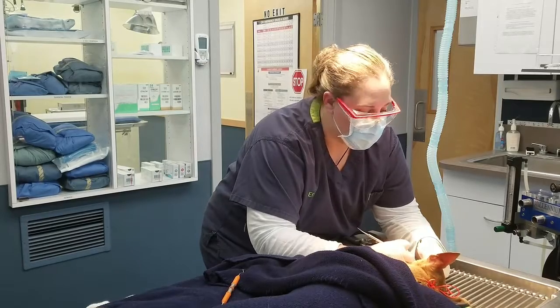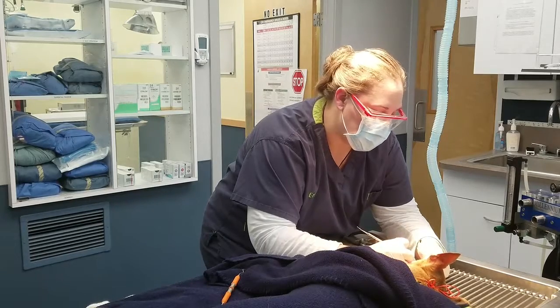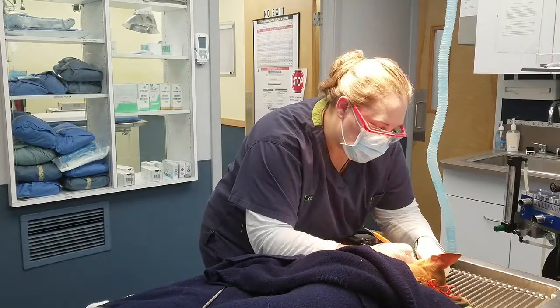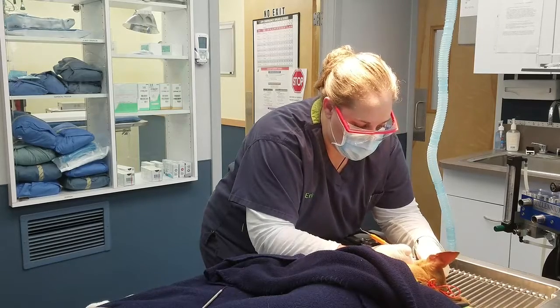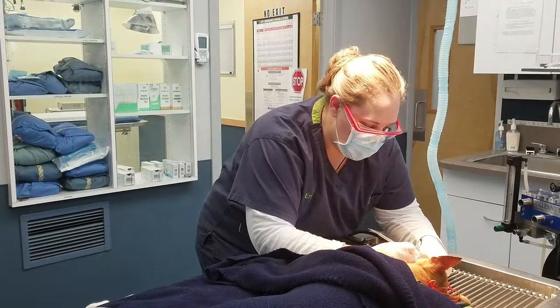Okay, and you should do that until you actually hear the tooth kind of squeak. Okay, and that means that you've gotten all of that residual debris off. And you move on to the next tooth. Okay, and so this is hand scaling.